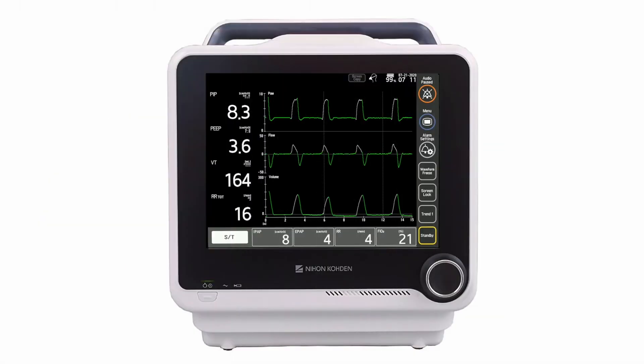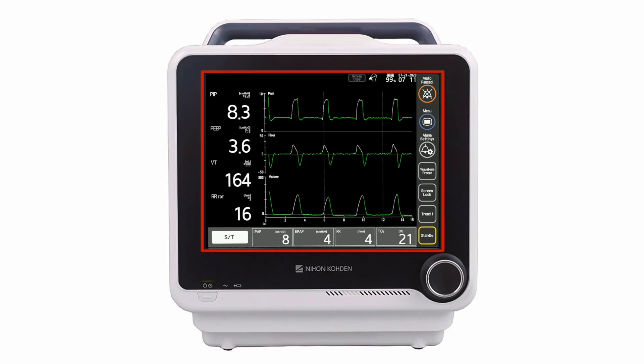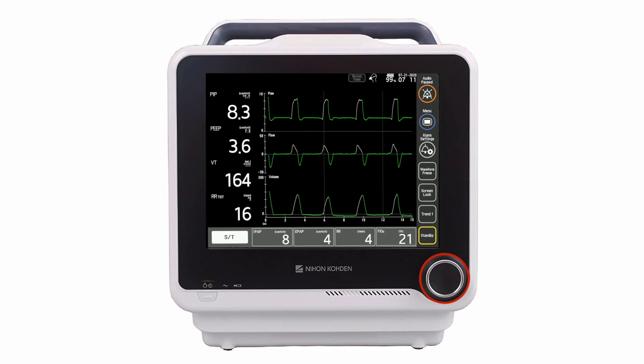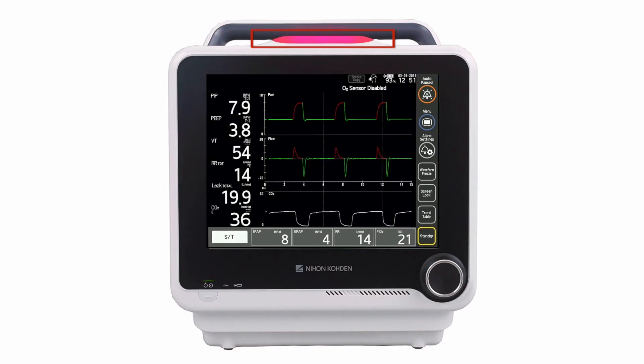On the front of the ventilator is the 12.1 inch graphical user interface, referred to as the GUI. Clinicians interact with the GUI both through the touch interface and the encoder knob. A large alarm indicator provides 360 degree visibility.